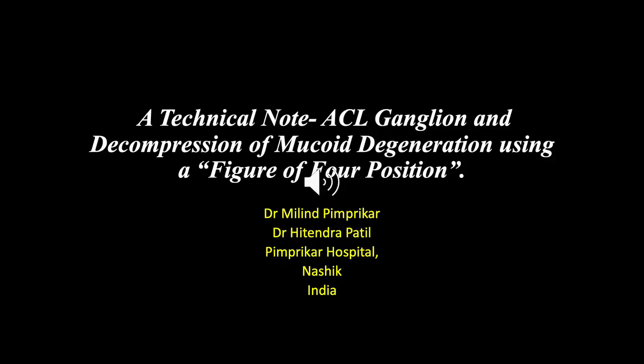A technical note: ACL ganglion and decompression of mucoid degeneration using a figure of 4 position.